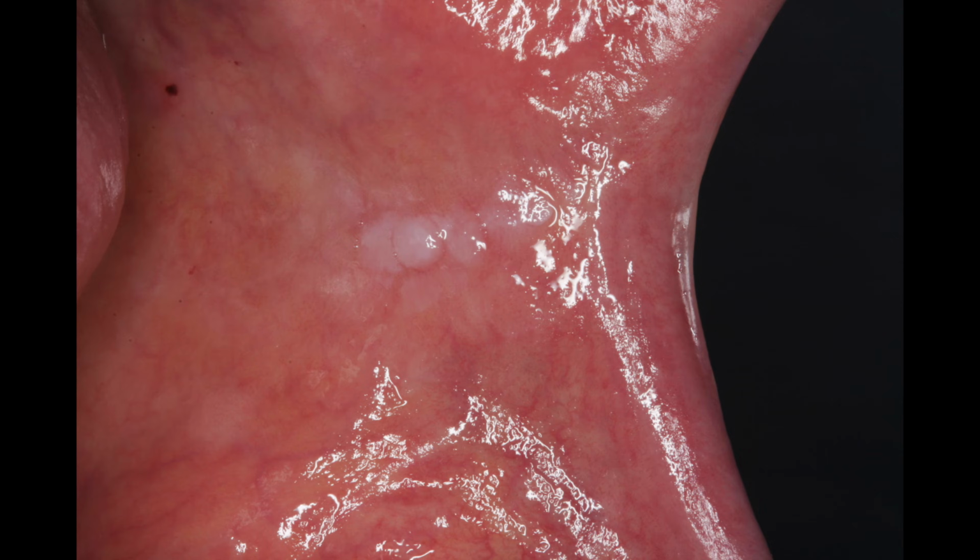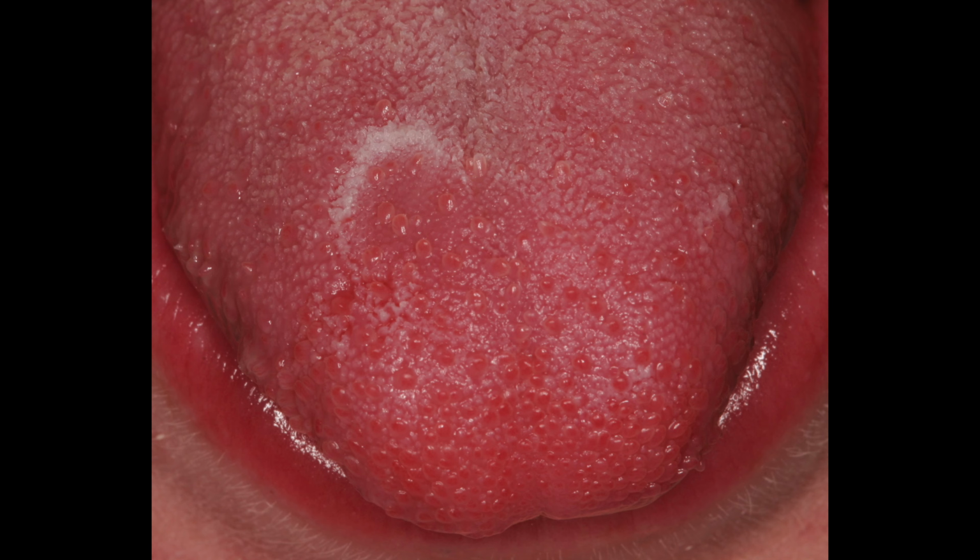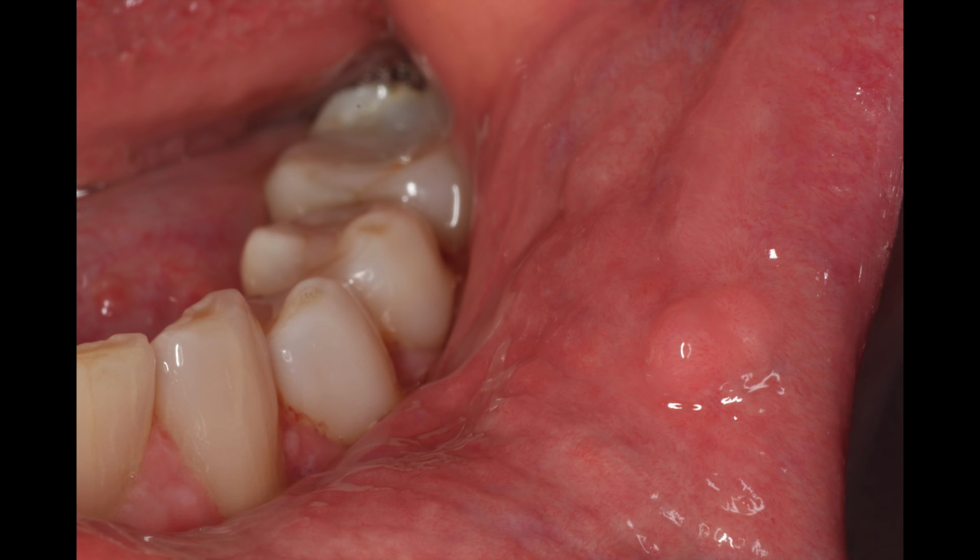If you're taking a photograph of a soft tissue abnormality, remember to dry the tissue off so as not to have a glare in the photograph. In this photograph, there is a glare overlying a leukoplakia, so it's difficult to determine the extent of the lesion, as opposed to this image in which the photographer dried the tissue off prior to the image.